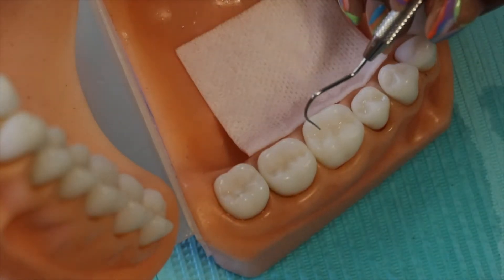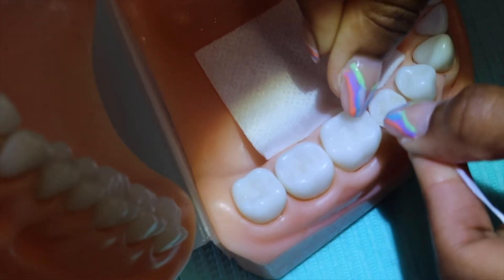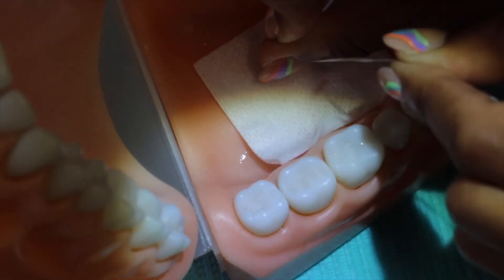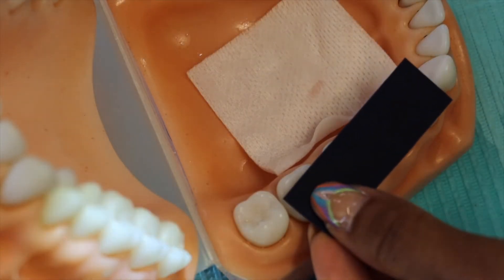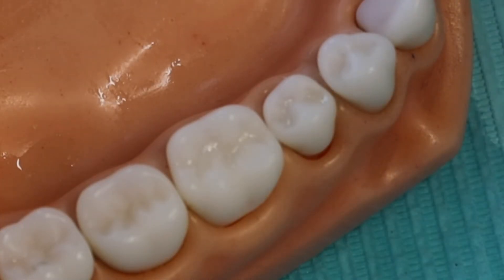Then we go ahead and light cure. Next, go in with an explorer and check to make sure all the grooves are sealed up nicely. Then make sure the contacts don't have any material in them — you should be able to floss in and out of the contact and around the whole tooth. Lastly, check the bite with articulating paper: place it there, have the patient close and grind side to side, and when you open it will show any areas that may be high. Now that you've seen it in a controlled environment, let's go inside the mouth to see how to manage the tongue, saliva, and keeping the area dry.